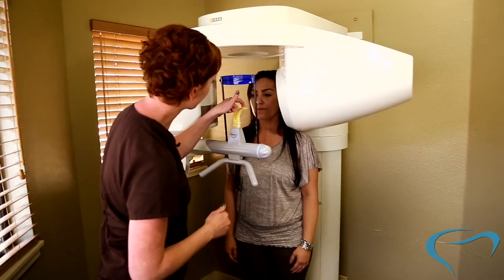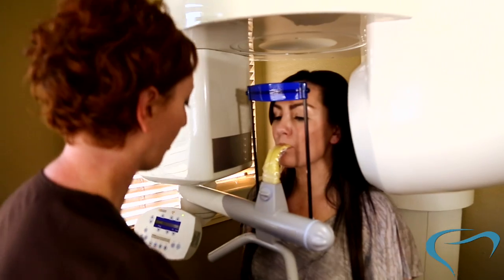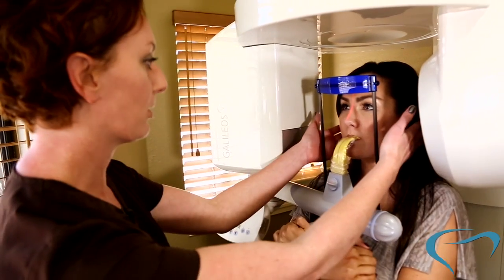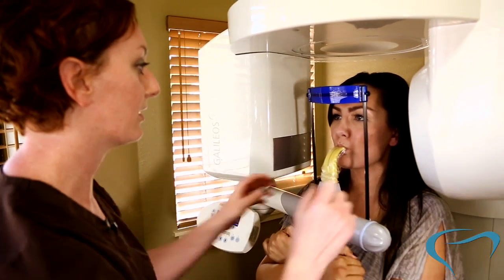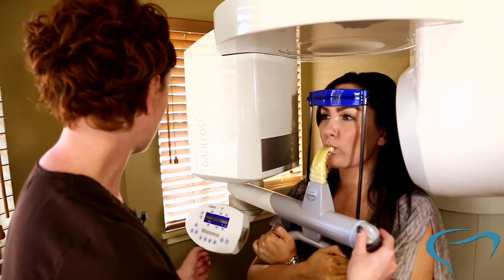Right here — you see that little ridge? I want you to go ahead and bite right there, come forward. There you go, perfect. And I'm going to position your arms here. Look straight at me for a moment. Good. And then I want you to go ahead and bring your lips around that like you're sucking on a straw. Good job. All right, so that is all set.